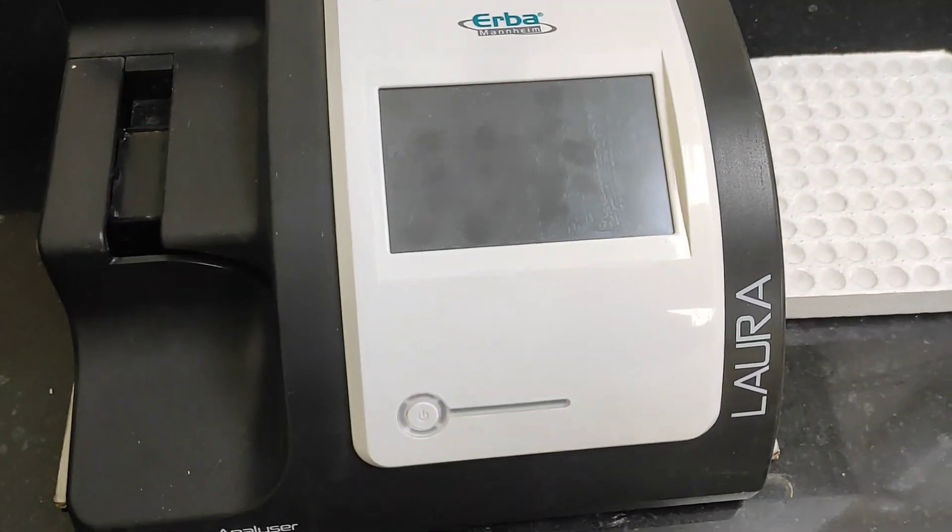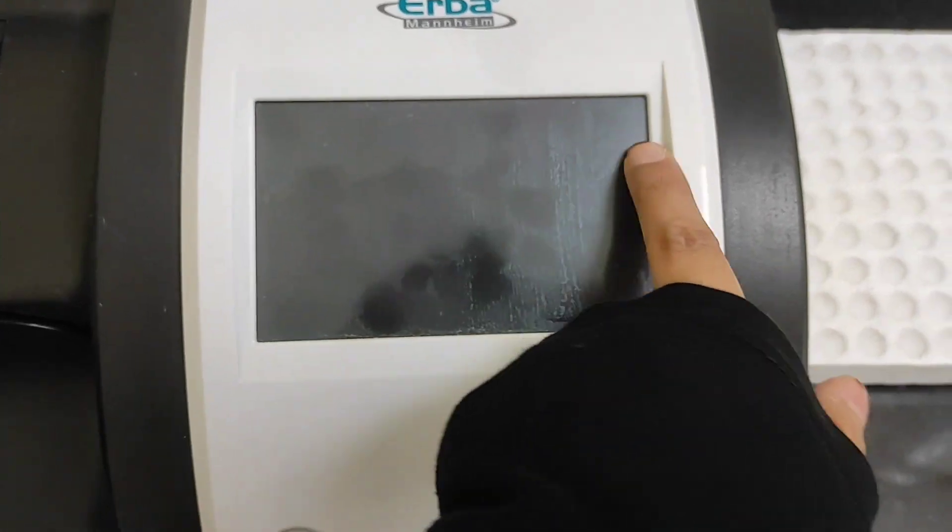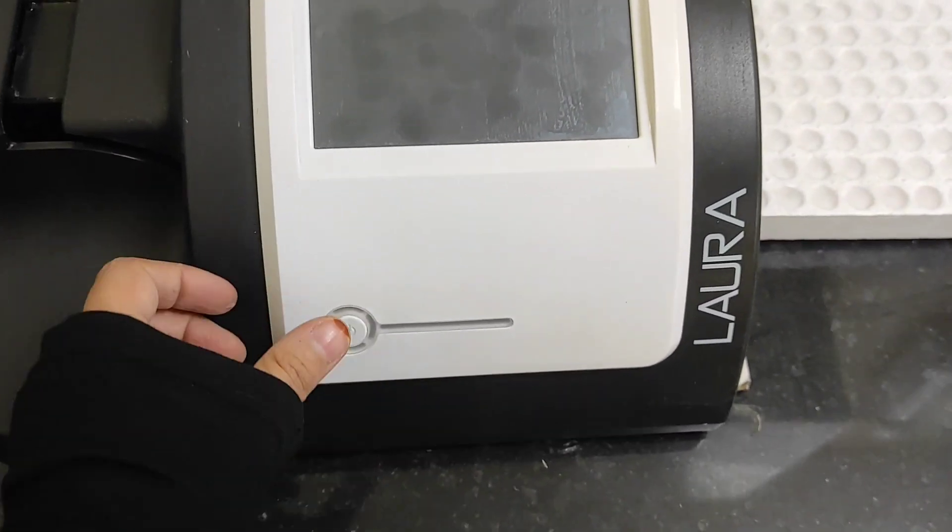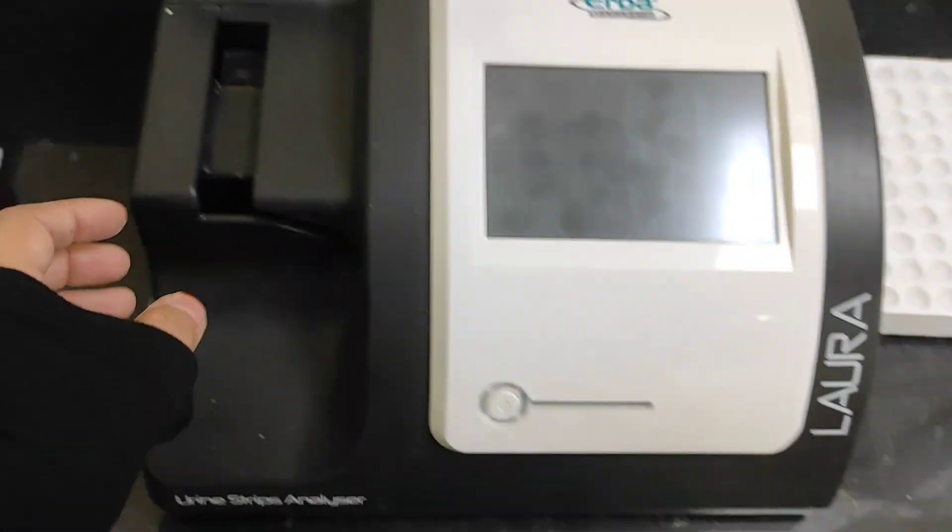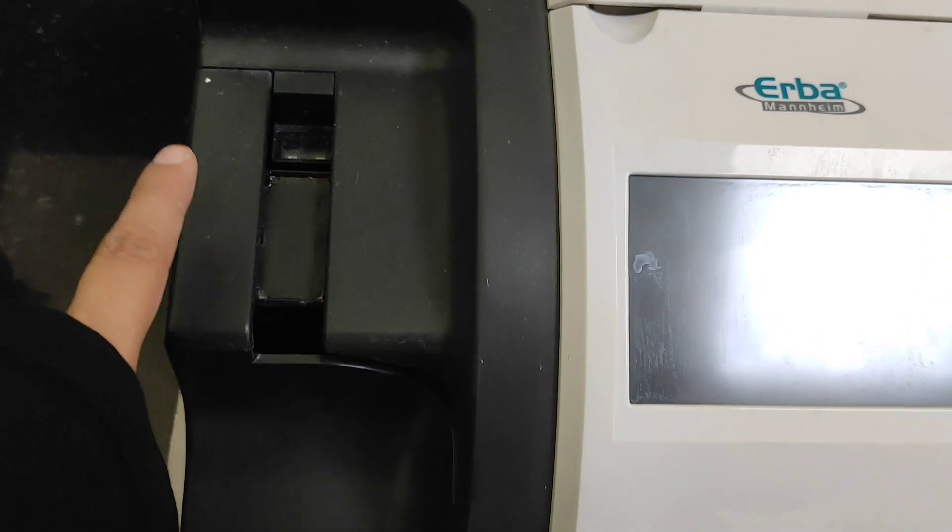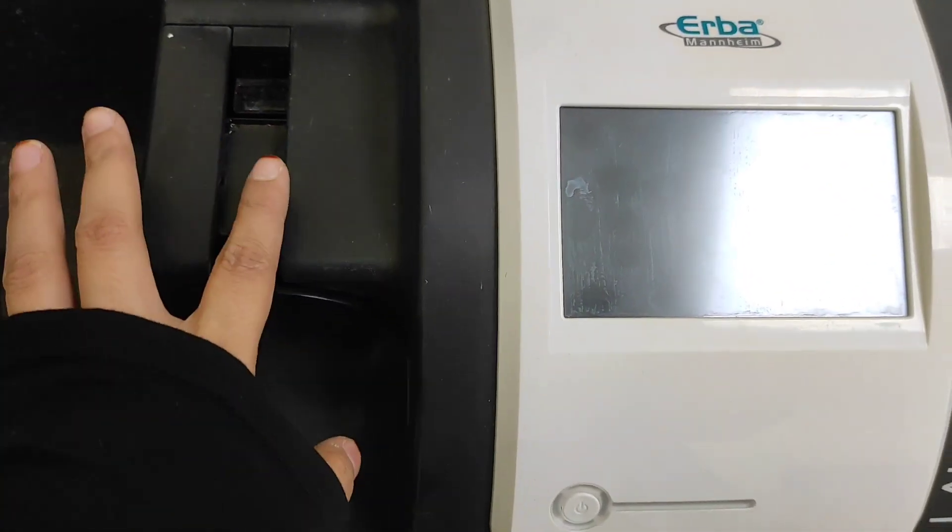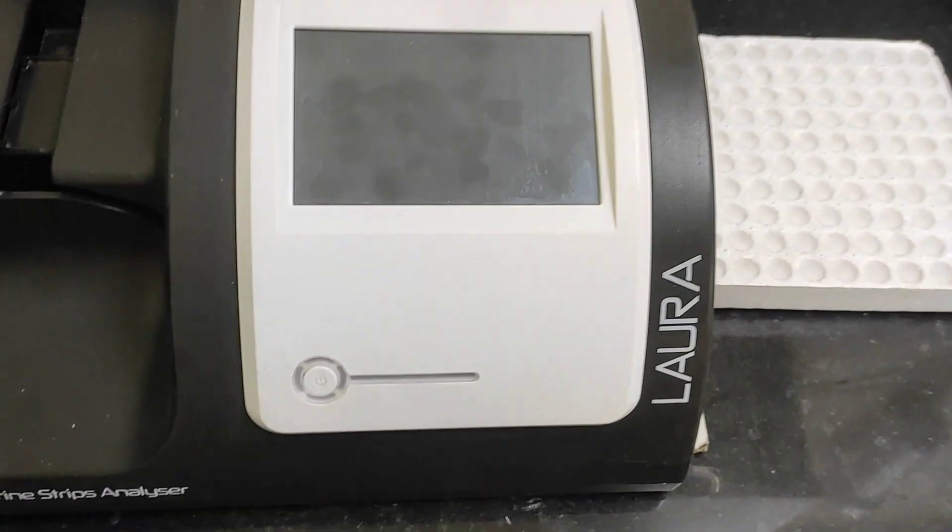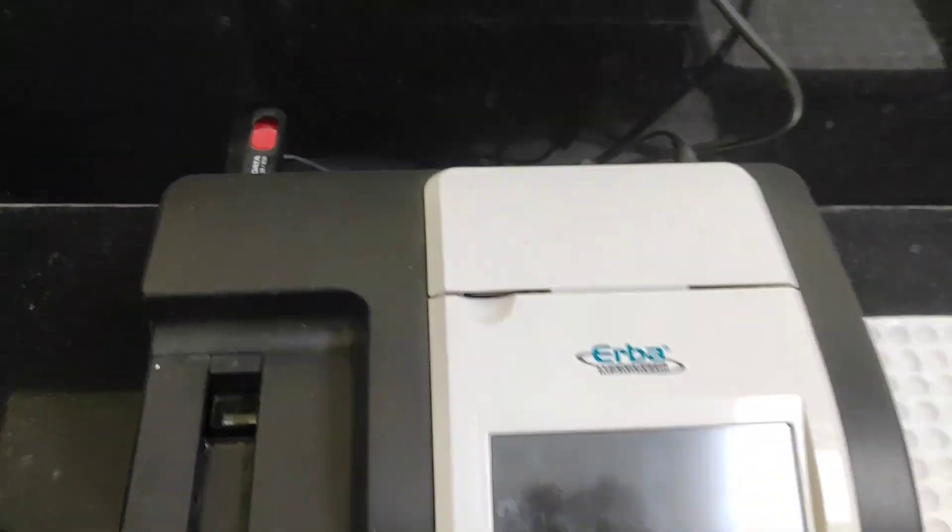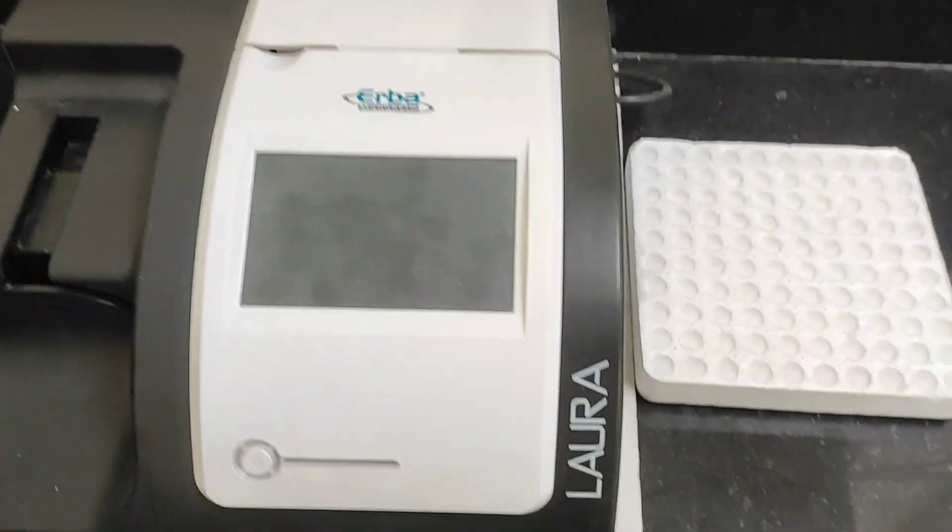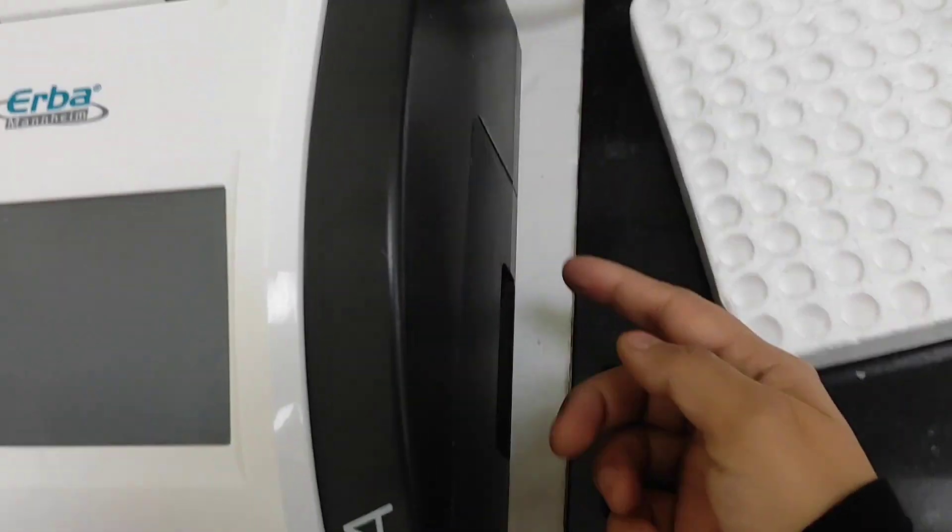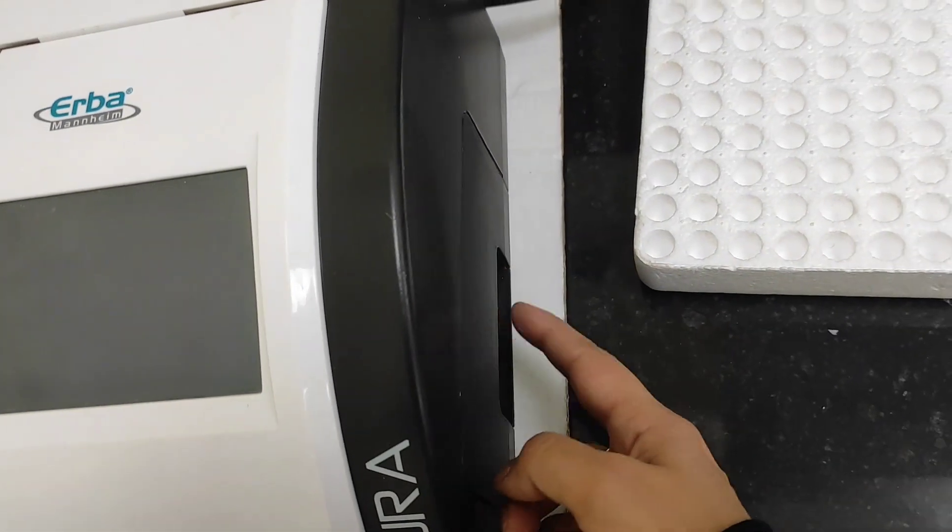Starting from the display, this here is the display and this is the switch on button here. This here you have to place the strip, the strip holder. And here as you can see this is the USB connected. This part is the tray, it just holds the urine strips.